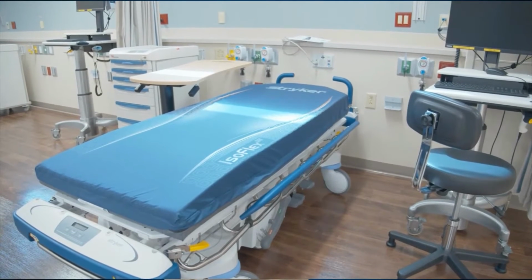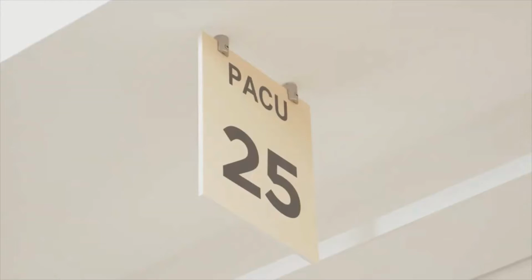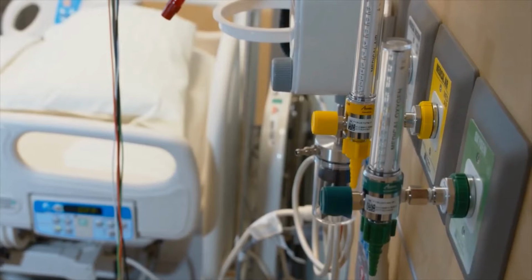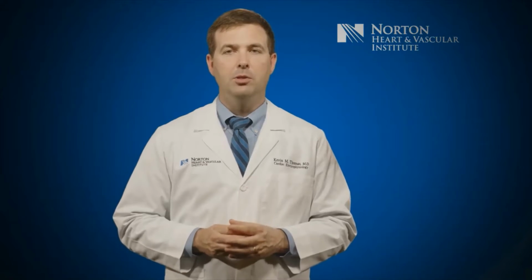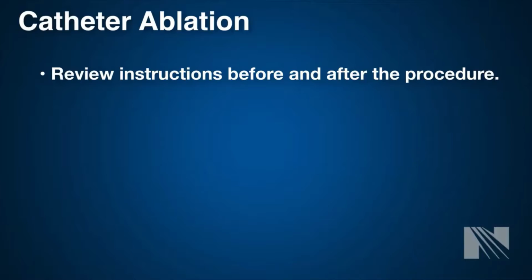Following your catheter ablation, you will be moved to a recovery area to rest quietly for several hours. Your heartbeat and blood pressure will be monitored continuously to check for complications. Often, patients are able to go home the same day, but your physician may elect to keep you overnight for monitoring. Be sure to review pre- and post documents on what to do before and after the procedure.